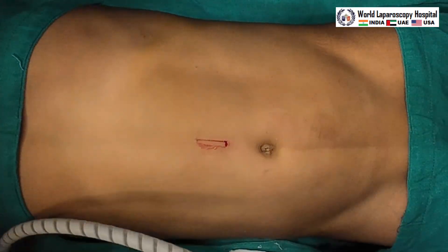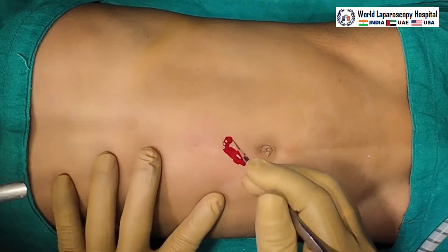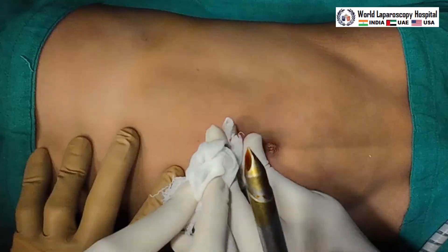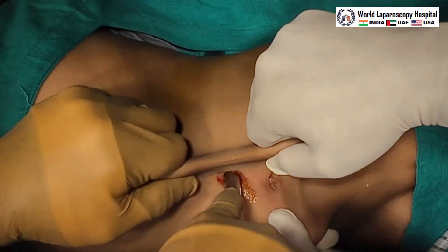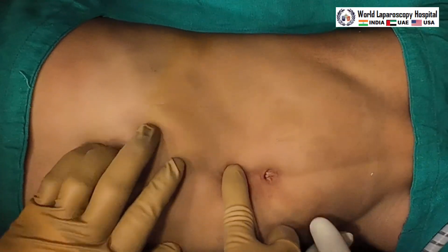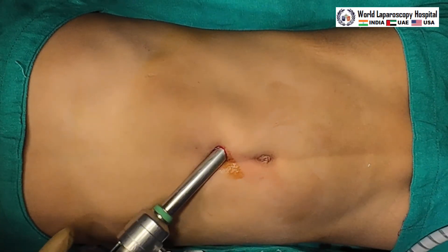The Veress needle is removed and the incision is enlarged for the optical trocar. We have to guard the trocar with the index finger in such a way that it should enter very smoothly without going much deeper, because in pediatric patients the aorta is very near to the abdominal wall and we have to be careful.